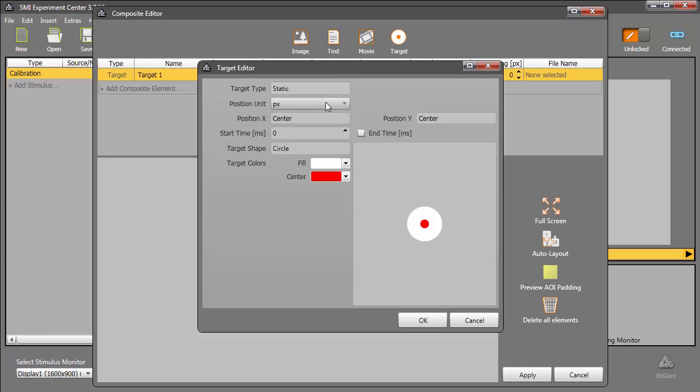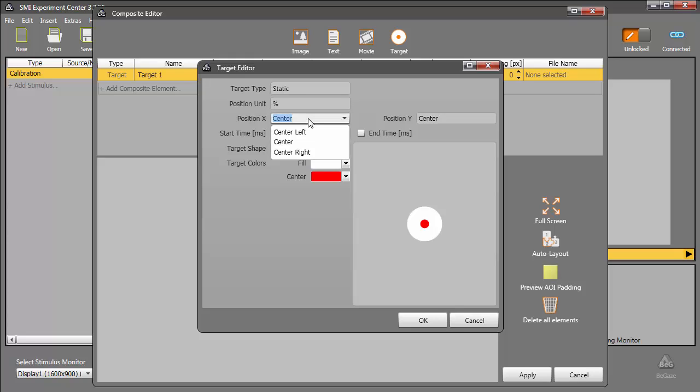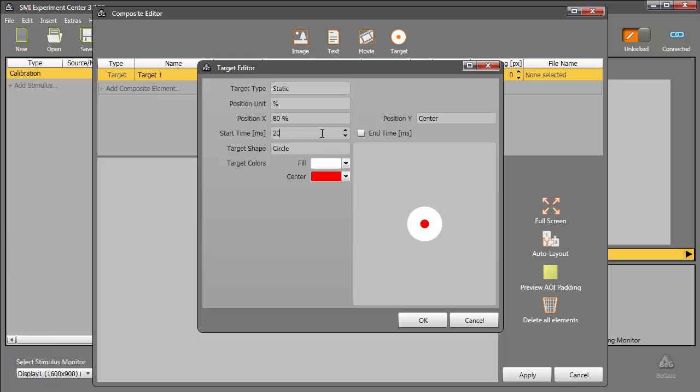Next, I'll set my target type to static and position unit to percent. Let's move the target to the right at 80% of the screen width, while remaining centered vertically. I'll set the start time for two seconds, right when the first target disappears. The target will be displayed for a total time of one second. Therefore, the total duration of the stimulus will be set at 3000 milliseconds, a value I'll set in just a moment.